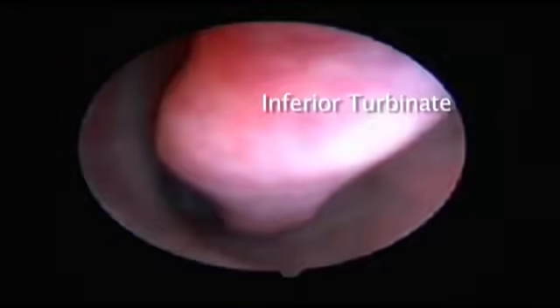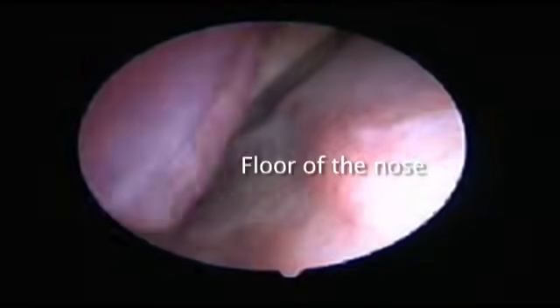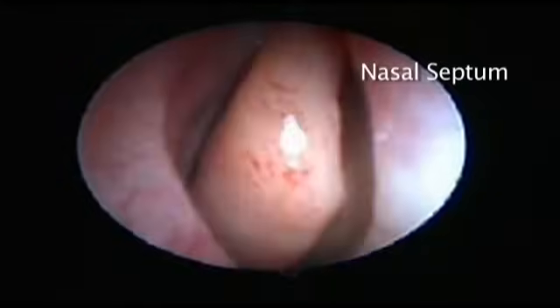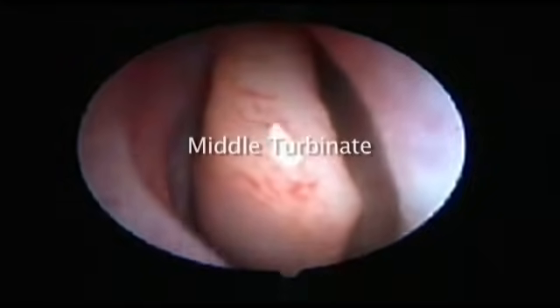you can see the inferior turbinate, the floor of the nose, the septum, and the middle turbinate.